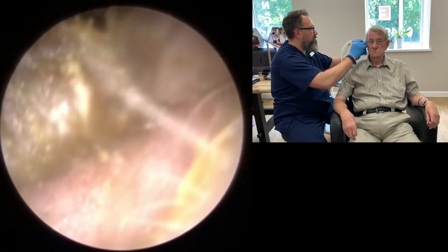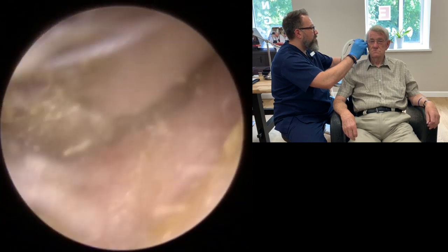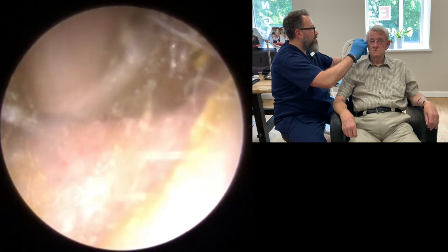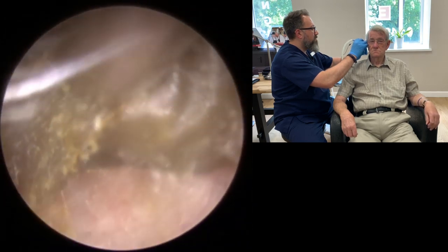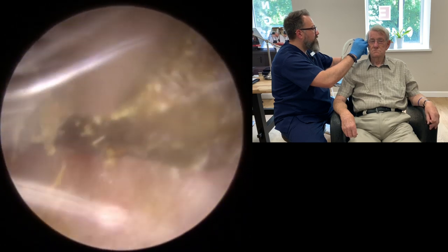See, slowly peeling this off the canal walls. So just working it around the outside edge first of all. With really sticky wax like this, if you try and just take it out and pull it from the center, all that happens is that the wax behind just sticks to the wax at the entrance and it all becomes one big mess.